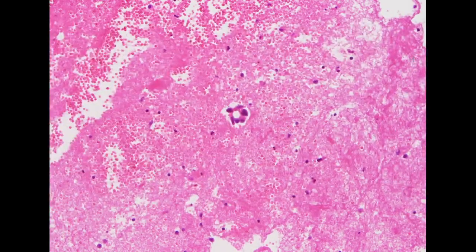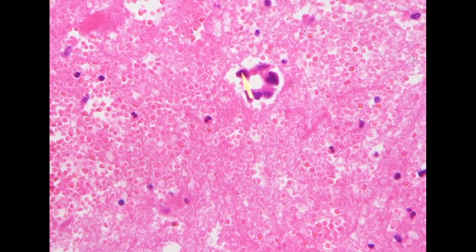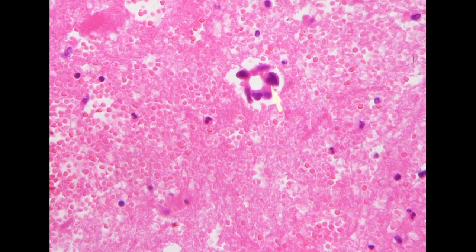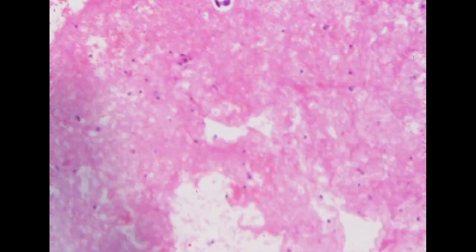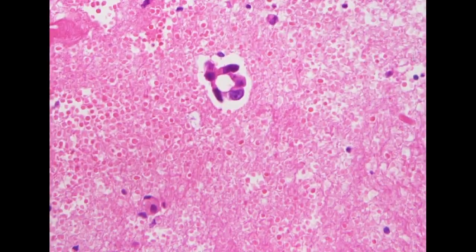So this one is more typical, with a traction artifact, a glandular arrangement with irregular polarity. So this has very, very scattered metastatic adenocarcinoma. So this is compatible with recurrence of the patient's adenocarcinoma.